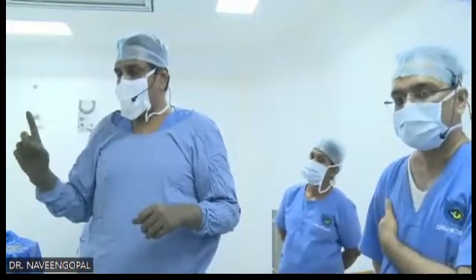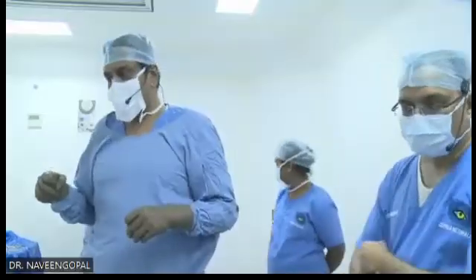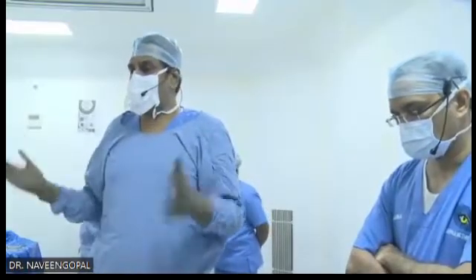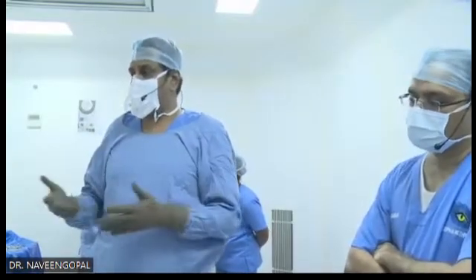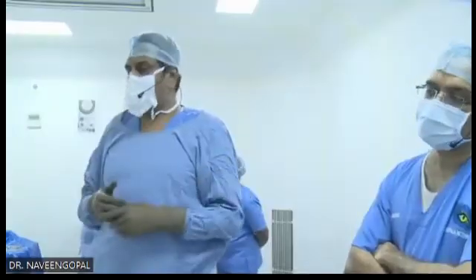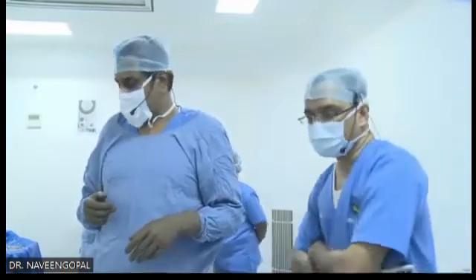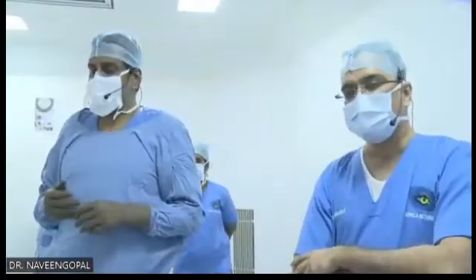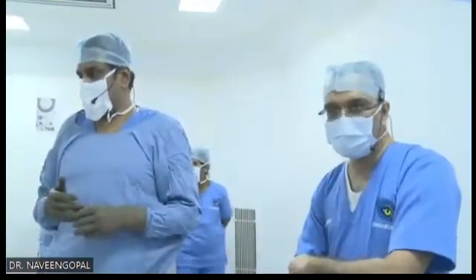Till now, only one like that, where the sizing of the ICL was wrong. Make sure the vaulting is more than half the corneal thickness. If you presume an average corneal thickness of 500, it should be about 250 microns. On an average, the vaulting you should expect is somewhere between 250 to 700 microns. Anything beyond or below that, you need to exchange. No second thoughts.